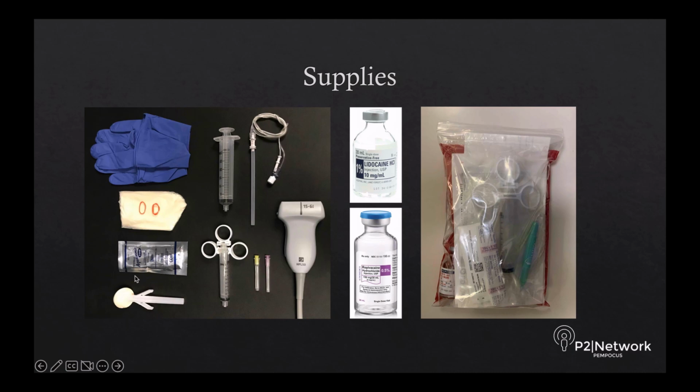You're going to have to choose one of two needle options. We typically use for our extremity blocks a hypodermic cutting needle. In this case, we've got a 27 gauge needle to be attached to a control syringe. We've also got an 18 gauge needle to drop our anesthetic.